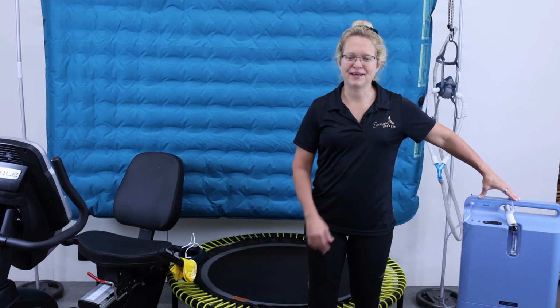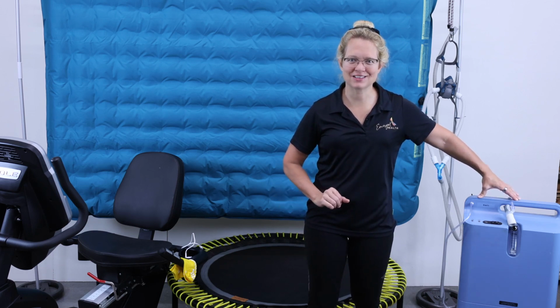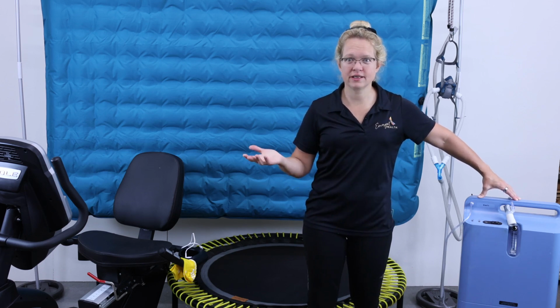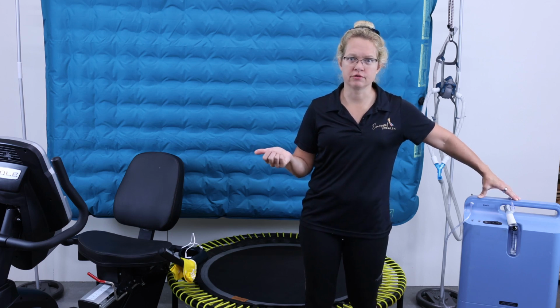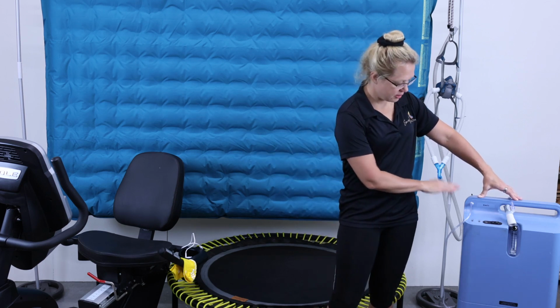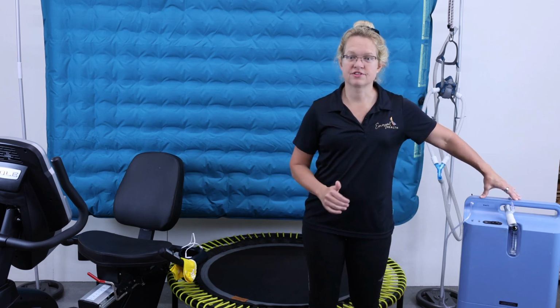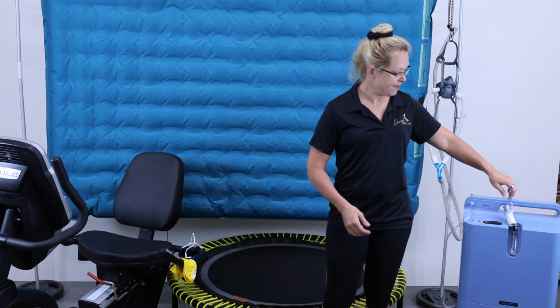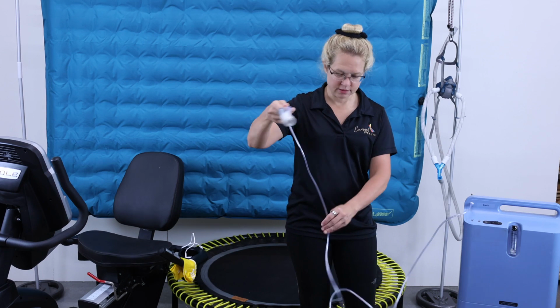During COVID, even the refurbished ones became very hard to find, and you had to get on a waiting list, so that caused some complications. But if you buy a new one, you can get it very quickly. They're about $600 to $700, depending on the oxygen concentrator you get. This exact brand is used for a lot of EWOT systems, so I just got the one that's typically used. You also have to make sure you have a hose, so you have to buy an oxygen hose.